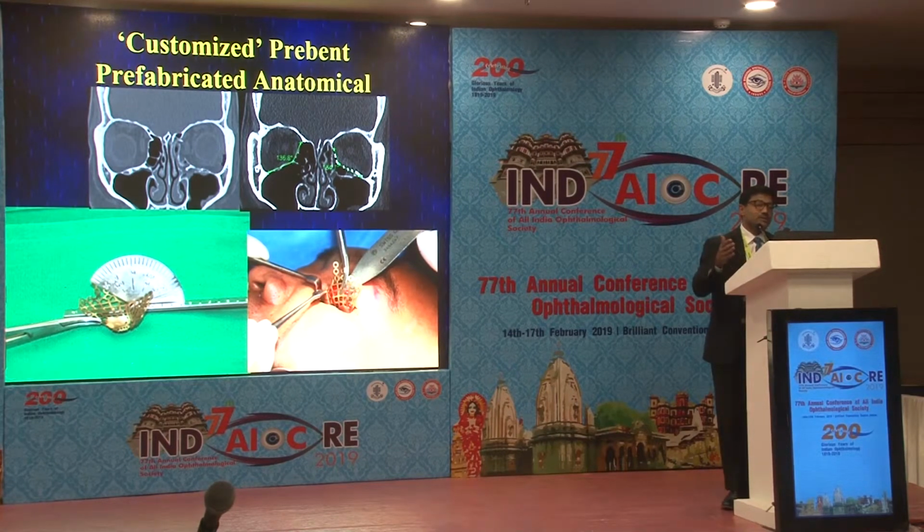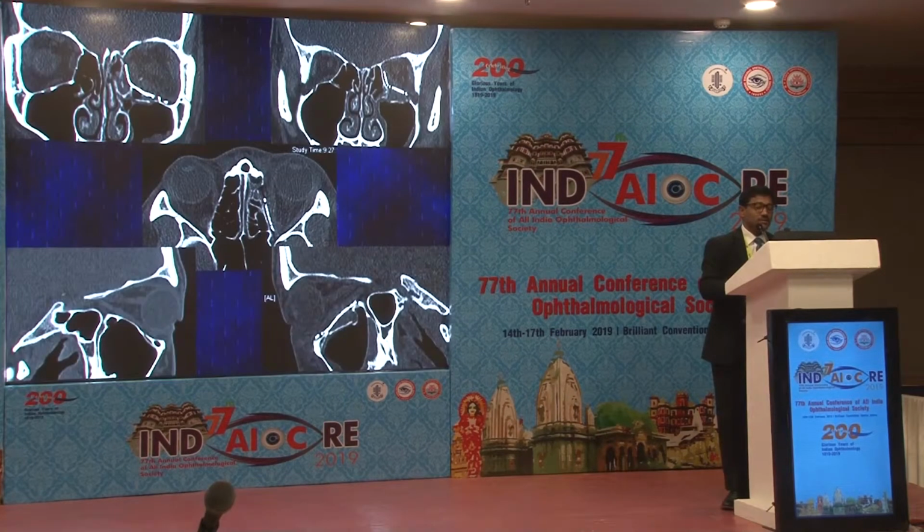And believe it or not, despite the textbooks that are written by Jeff Nerad and Jack Rootman and so forth, they don't touch upon it. Everybody's angle is very different. So if you have a unilateral displaced fracture, we measure the contralateral angle, anterior, mid, and posterior, pre-bend these anatomical implants, and then place it inside the orbit itself.